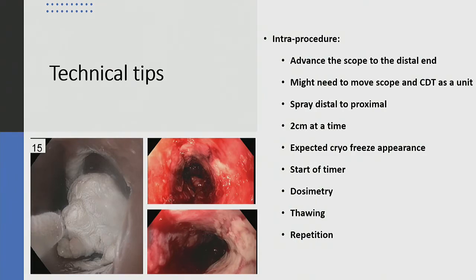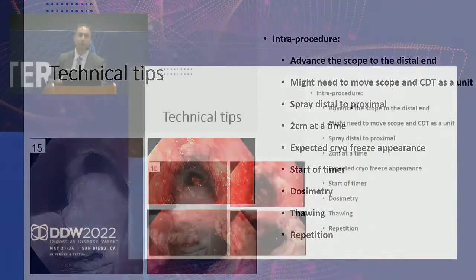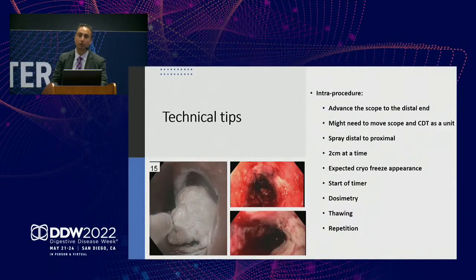In frostbite, the recommended treatment is a rapid thawing of your fingers, because you get less damage. So it's important to have the thawing be slow when you're trying to kill the cancer, and repetition. And I think probably the third treatment is the most effective because you get the fastest freeze.